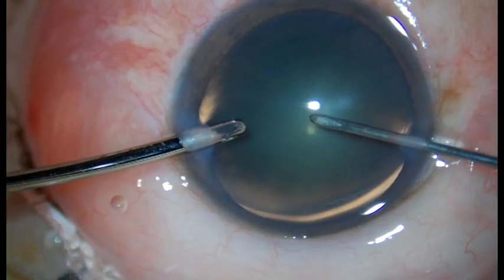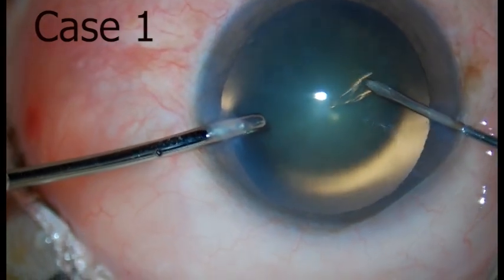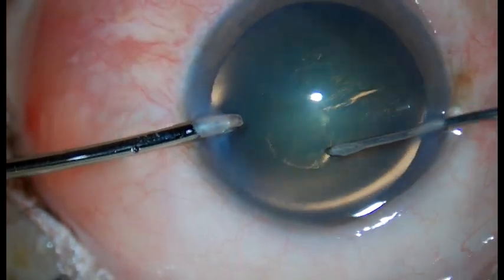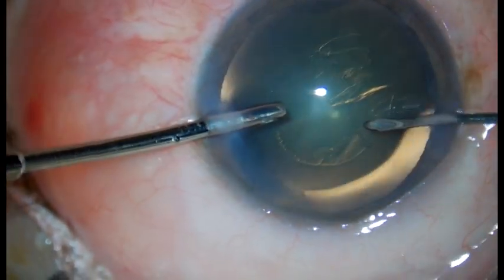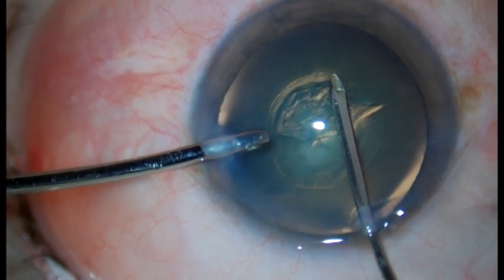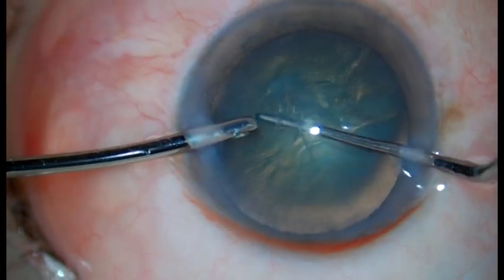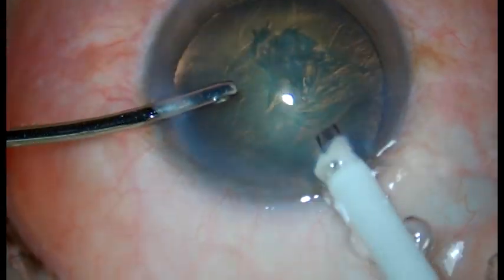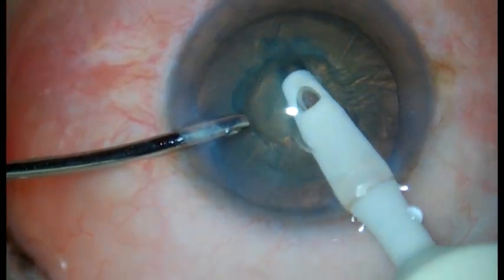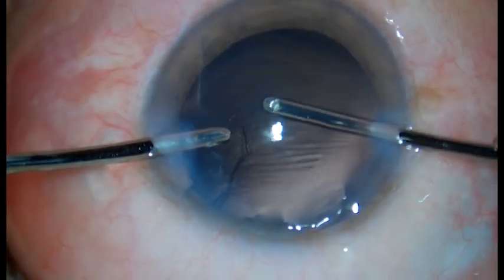Hello everybody. We are demonstrating phacoemulsification in 8 cases with different grades of cataract without use of viscoelastic. During phacoemulsification, viscoelastic is mainly used during continuous curvilinear capsulorhexis and while implanting the intraocular lens. Its basic benefit is maintenance of the anterior chamber, which helps in easy maneuverability.